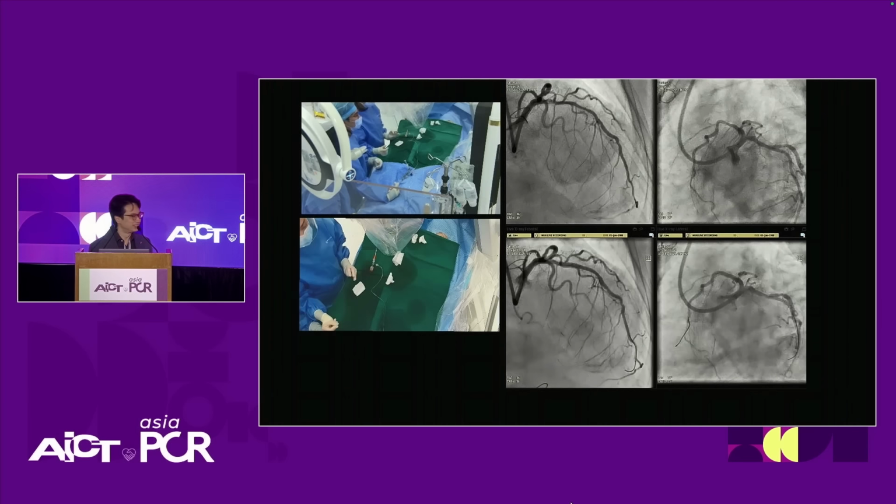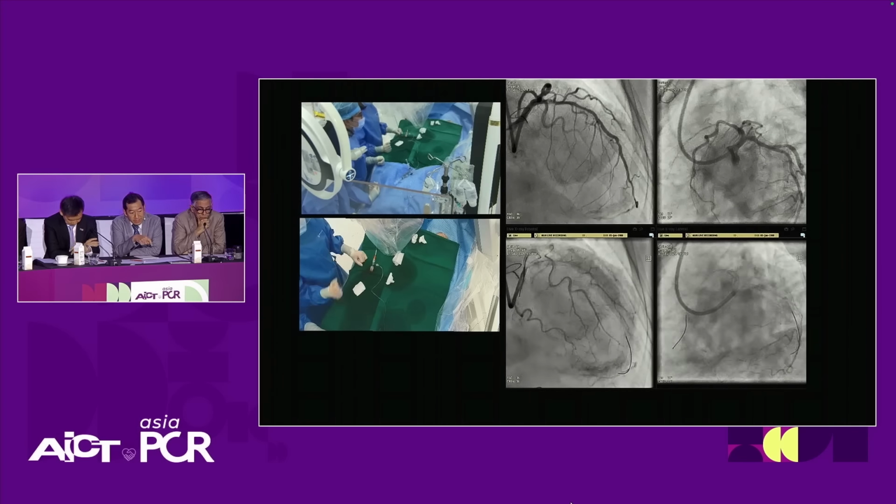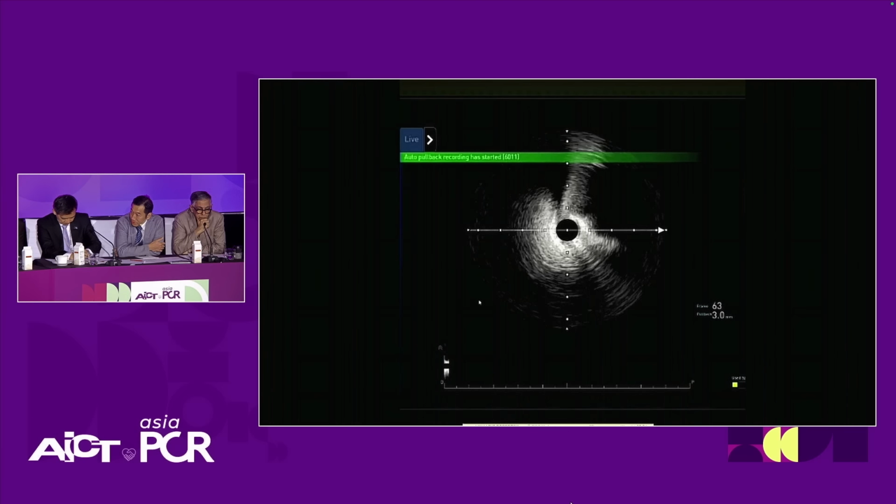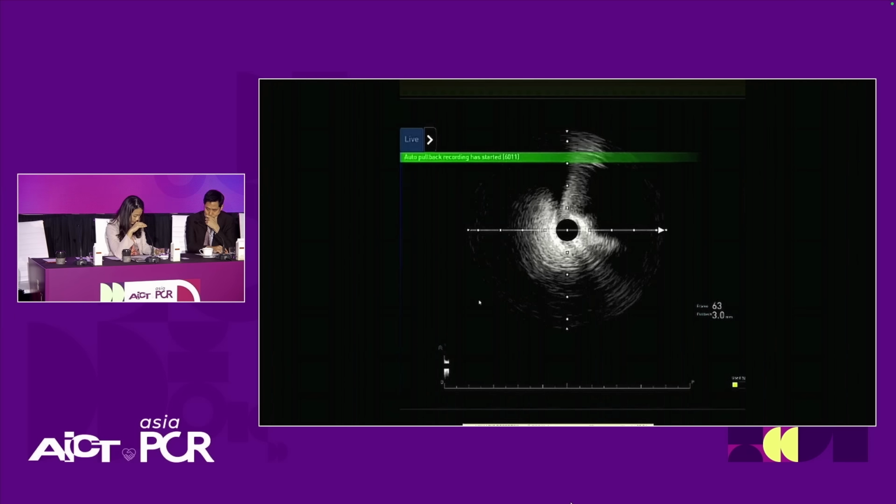But Hui Wen, that balloon has a bit of a waist still, right? Just now, I mean, is that acceptable? How do you decide whether to go higher? If it's the part where I want to do a DCB strategy, I think anything less than 30% should be fine. Otherwise, we can use the IVUS to reassess again and see what we need to do further.